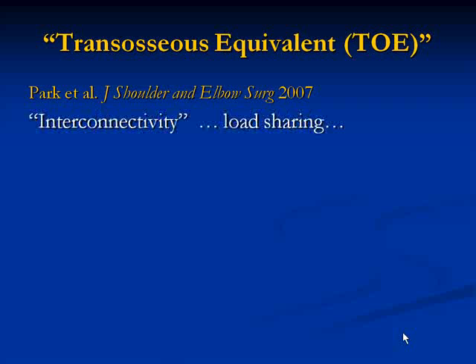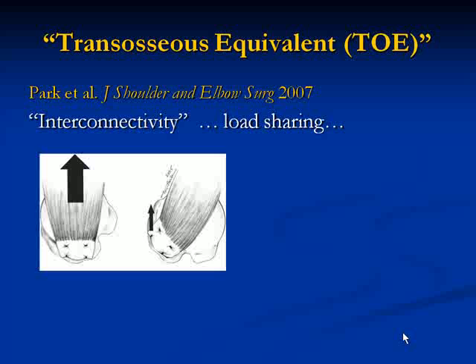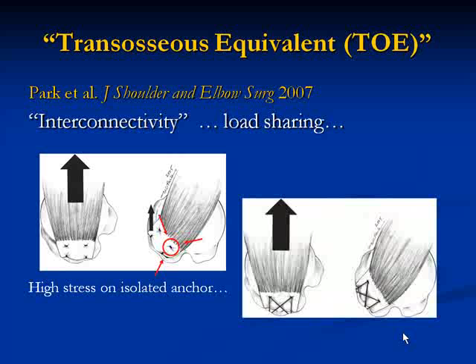And their explanation for why this might be occurring is due to the interconnectivity or load sharing between the implants. When we see a standard double row technique, each of the suture anchors is an isolated entity. And when the arm is passed through a rotational motion, different anchors are faced with a different amount of stress concentration. And so the leading anchor with rotation of the arm can be subjected to disproportionately higher amounts of tension. Whereas with a suture spanning type of arrangement, because all of the implants are interconnected, there is perhaps a more even distribution of the forces on the tissue throughout the range of motion.